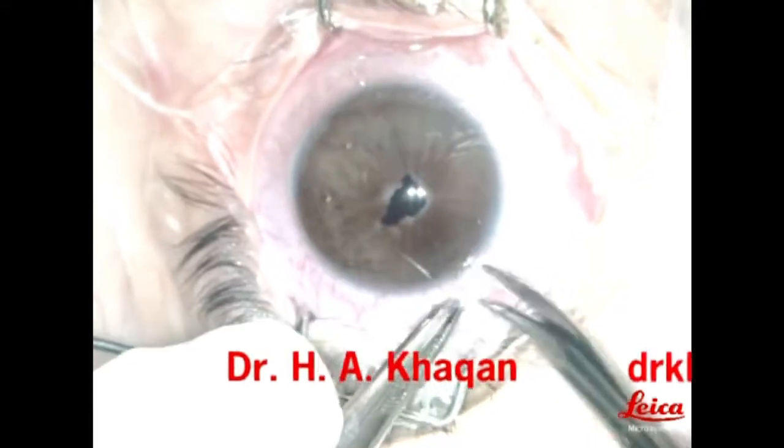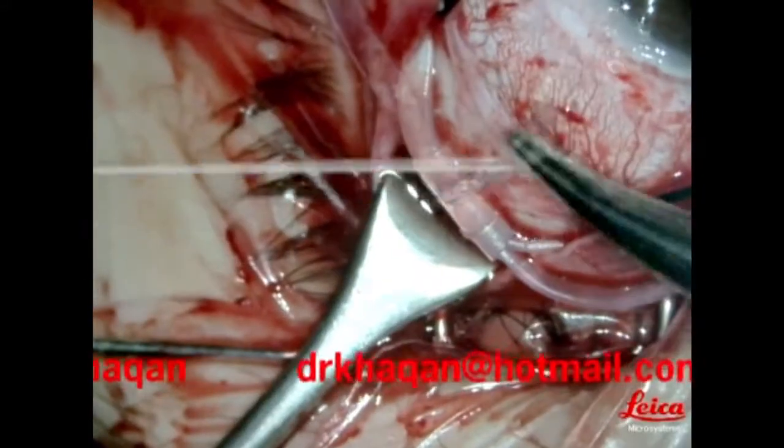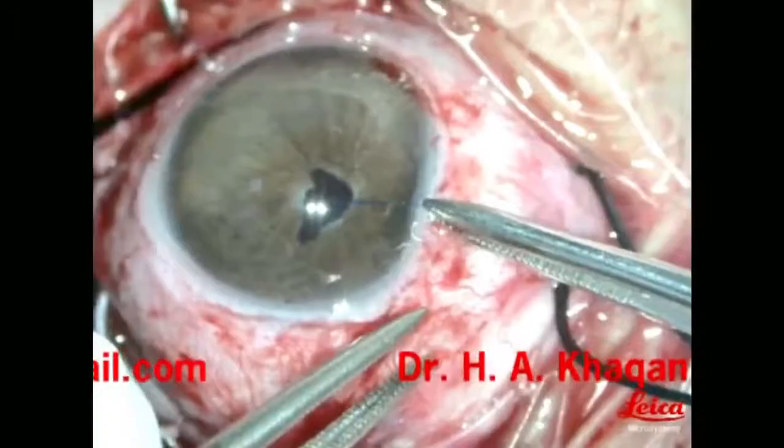360-degree peritomy was done and a 360-degree encircling buckle was placed. Iris hooks were then inserted.